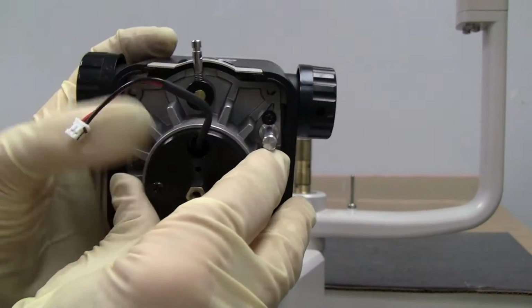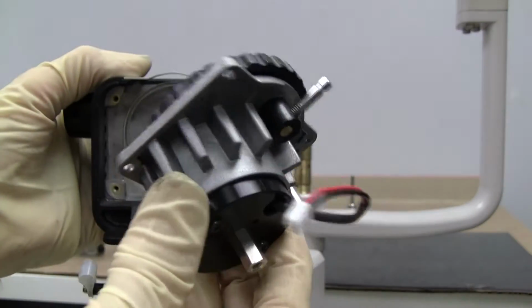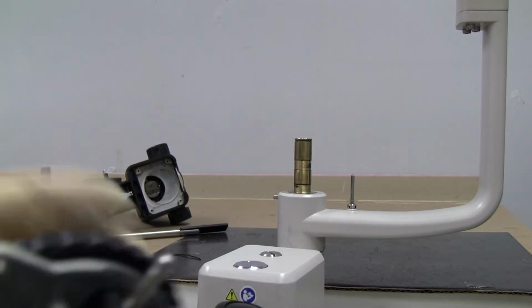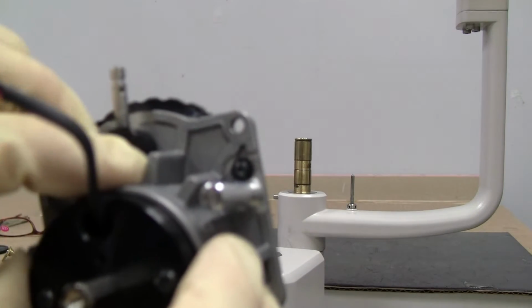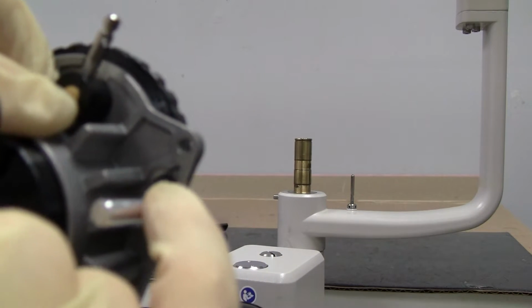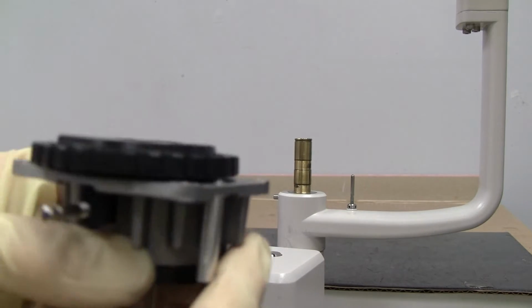Once you've taken those 4 corner screws out, you can pull this assembly out of the way. Put this to the side. And I can tell someone's been in here before because this screw is a little bit boogered, like someone's been adjusting it.